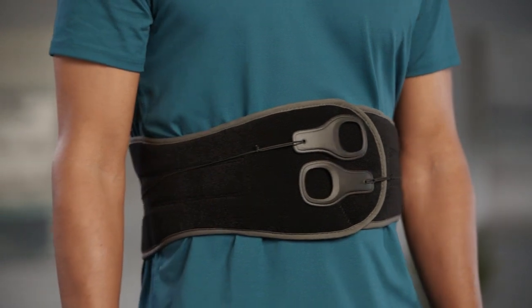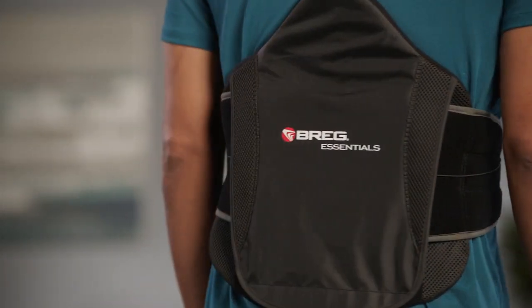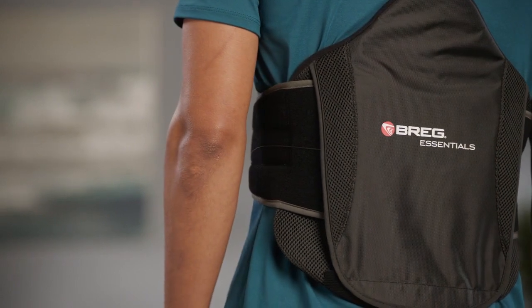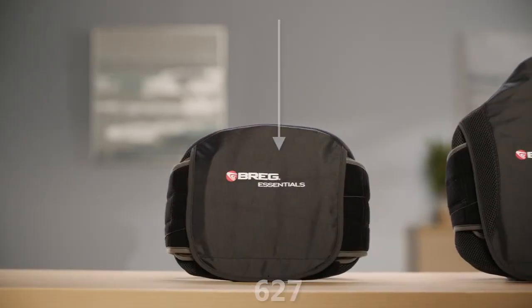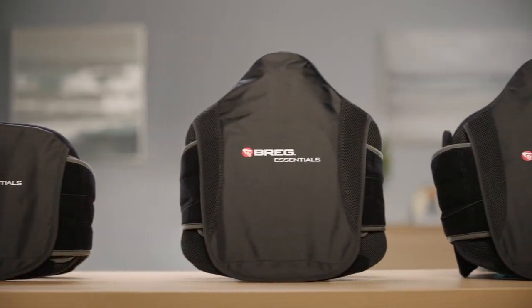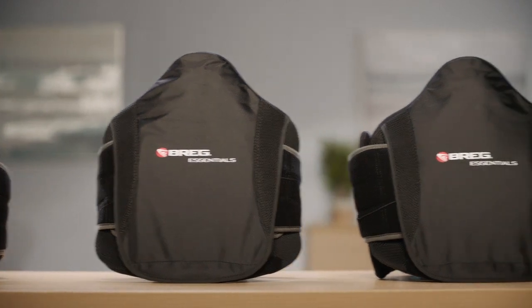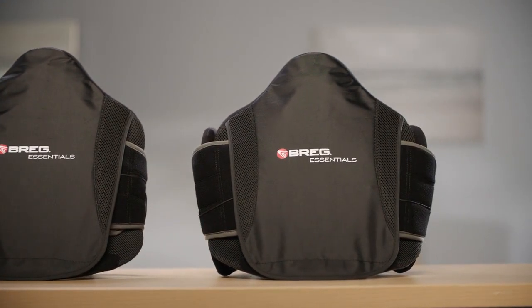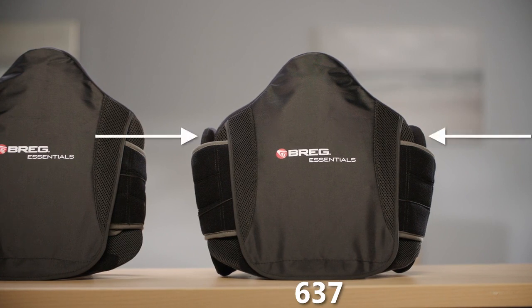In this video, we'll show you how to measure and fit a patient with the Essentials Spine Brace line. The Essentials Spine Brace family includes the 627 lumbar orthosis, the 631 with a taller posterior panel, and the 637, which has the same panel as the 631 but with lateral pads.